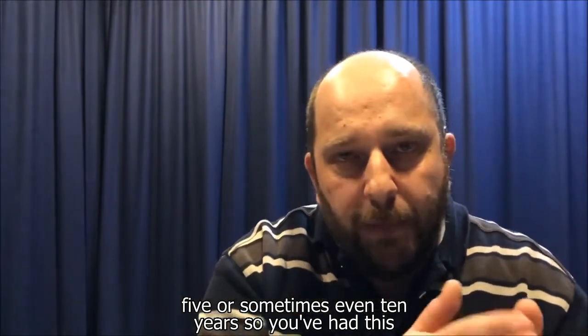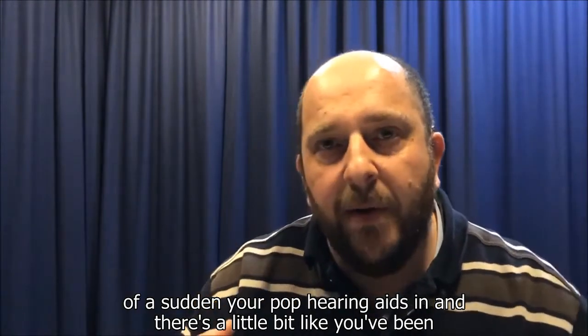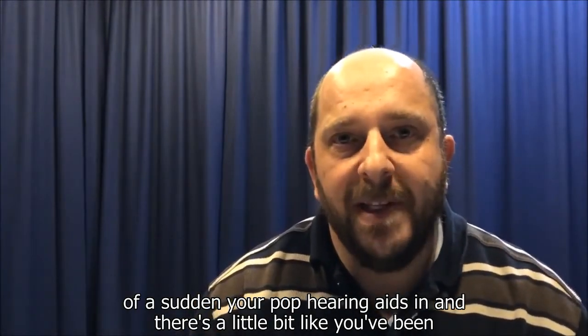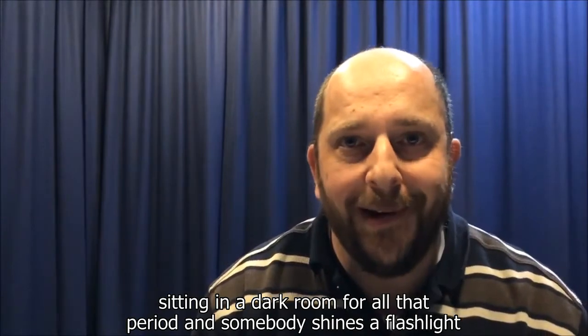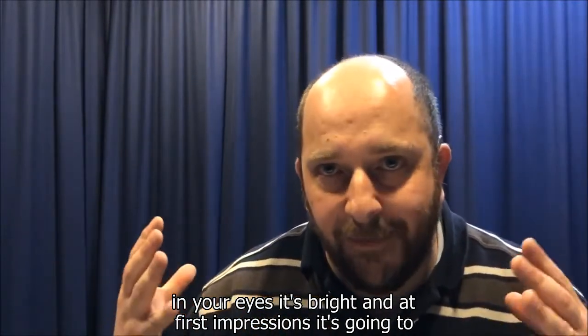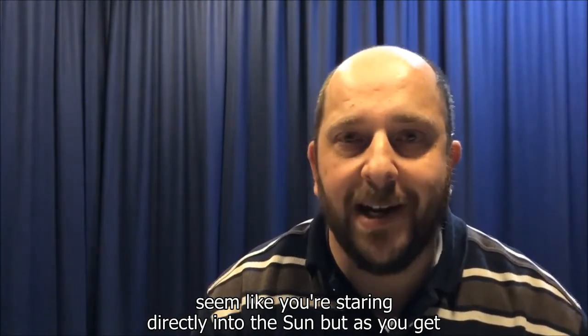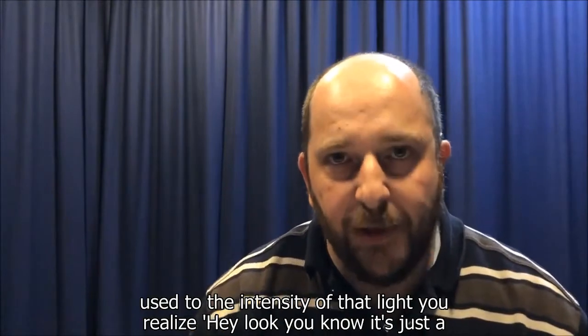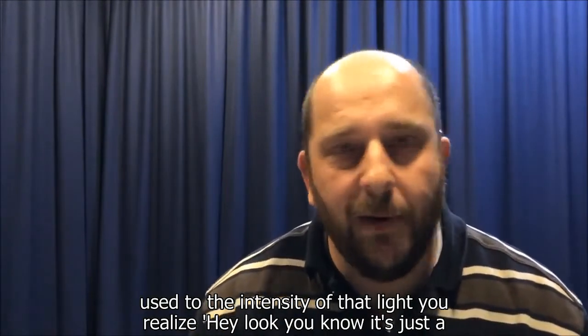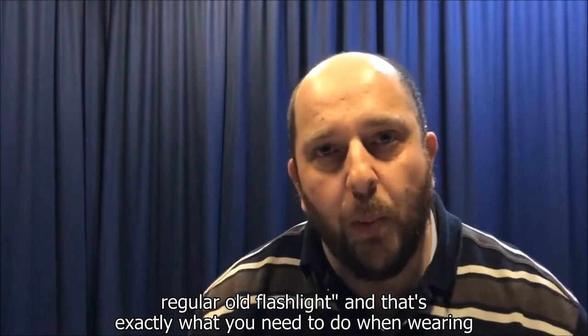So you've had progressively deteriorating hearing over that period of time, and all of a sudden you pop hearing aids in, and it's a little bit like you've been sitting in a dark room for all that period, and somebody shines a flashlight in your eyes. It's bright, and at first it's going to seem like you're staring directly into the sun. But as you get used to the intensity of that light, you realise it's just a regular old flashlight. And that's exactly what you need to do when wearing hearing aids.